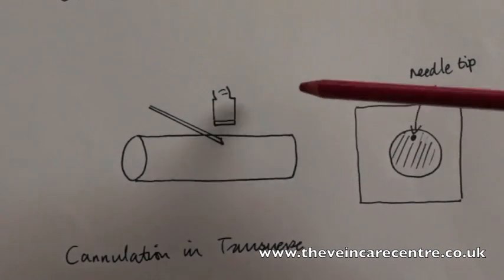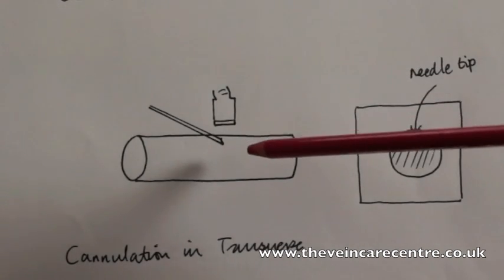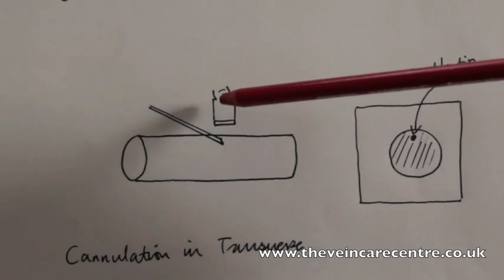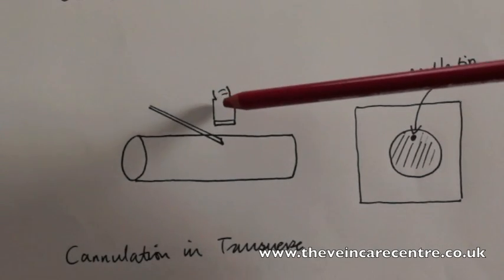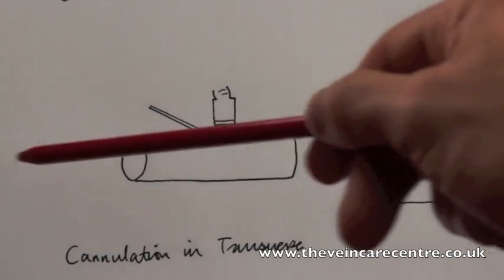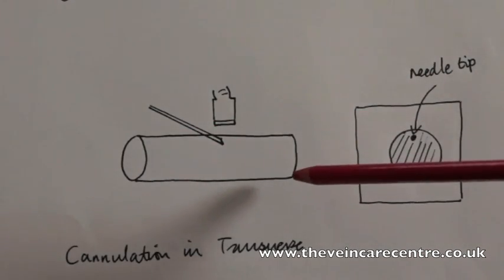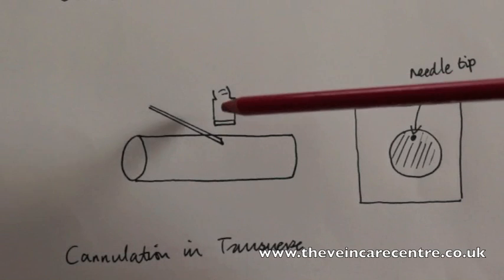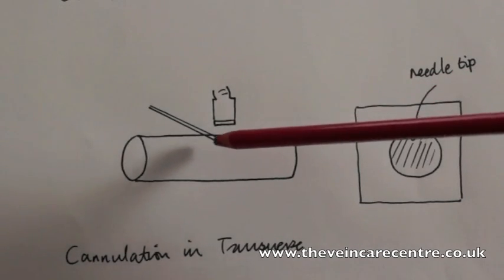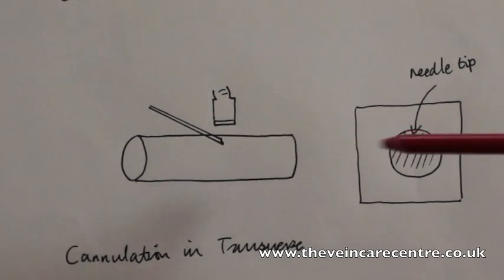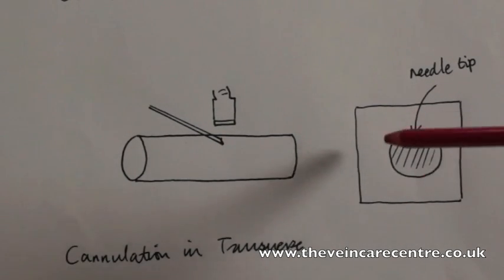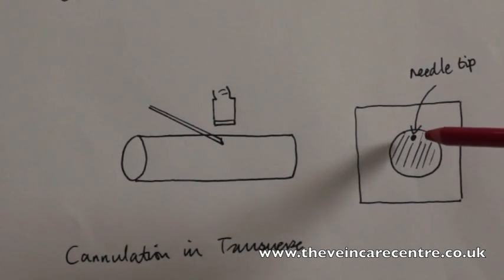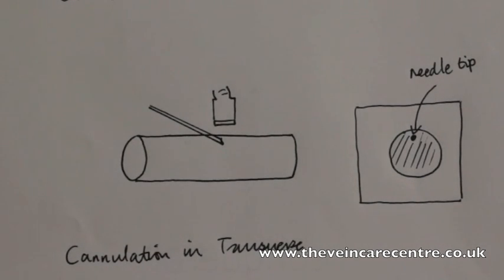Here we can see the blood vessel being cannulated with the transducer in transverse section. The long axis of the transducer is at 90 degrees to the long axis of the blood vessel, and the probe is here directly over the needle tip as it's entering the blood vessel. On the ultrasound, we can see the blood vessel as a circle, and the tip of the needle appears as an echogenic point within the lumen of the blood vessel.